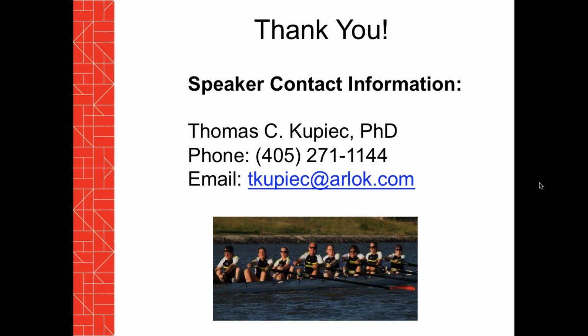That's a very good, important point. 71 is intended for finished product testing, for the finished product. And that's not to ignore the fact that you should verify and validate your processes, which is the first thing we stated and put in bold and in red. Let me go back here.